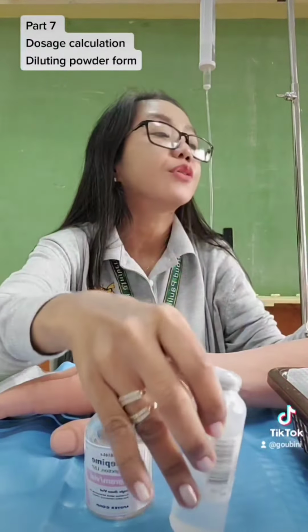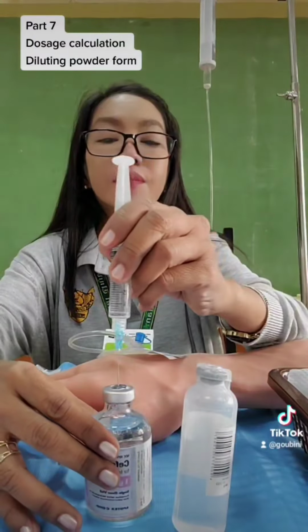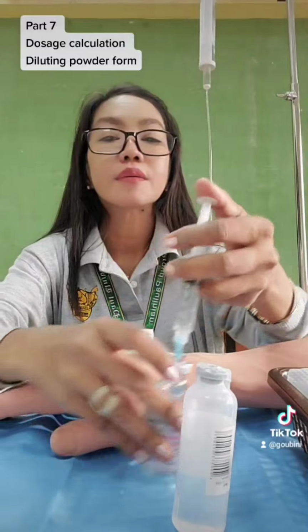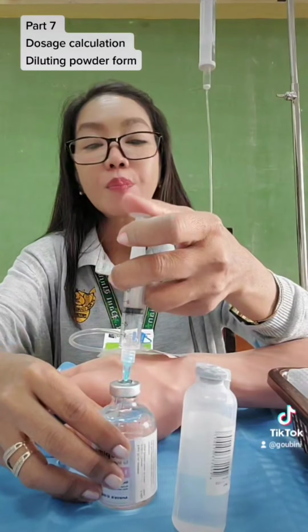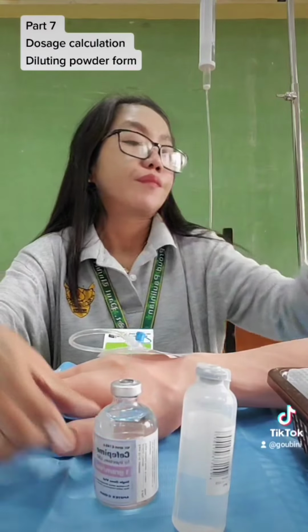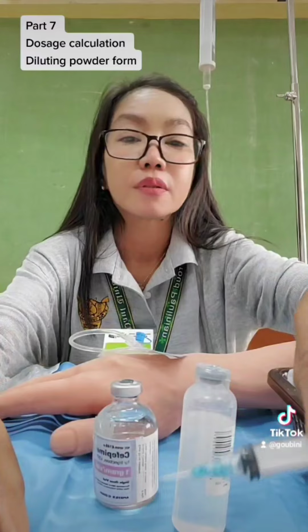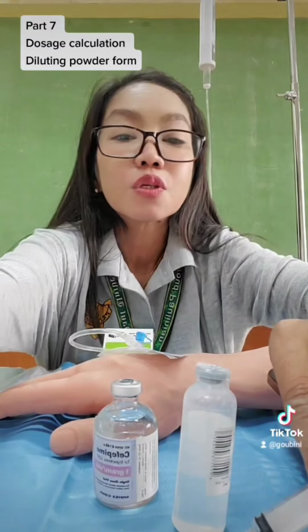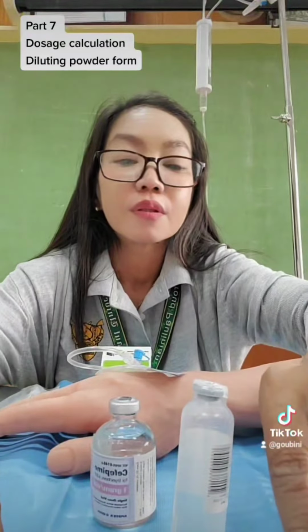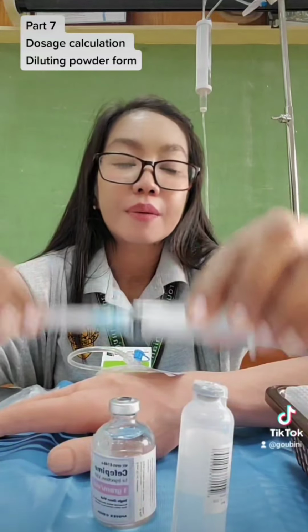Alright, you have another 5 cc, for example. So this is the proper way. Then you use your scooping method in recapping.